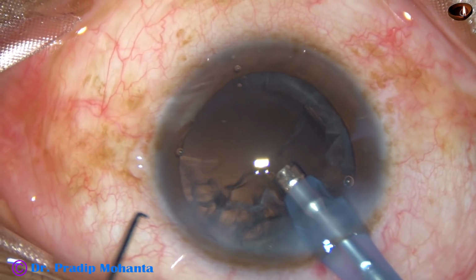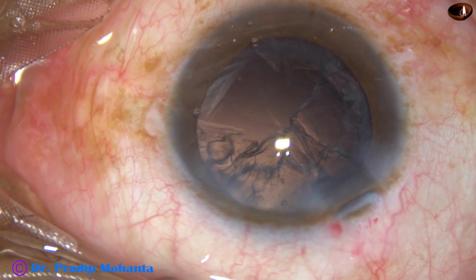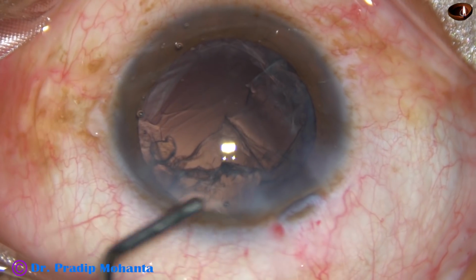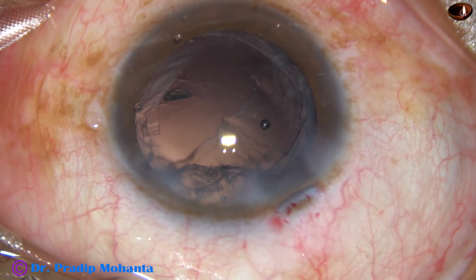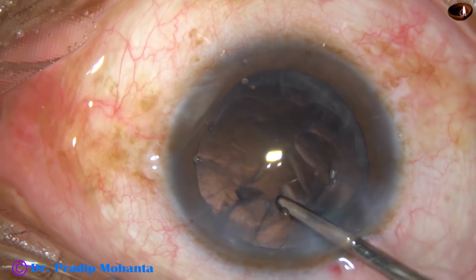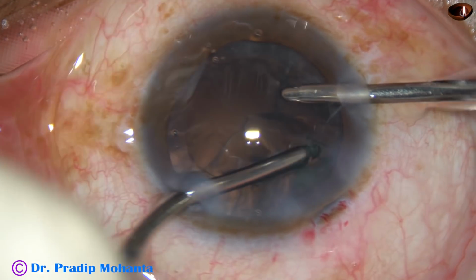Be very meticulous, very careful, take your time, protect the corneal endothelium, protect the posterior capsule, inject viscoelastic substance in between whenever you need, and do a safe surgery. I can do a surgery in 6 minutes, in 8 minutes. You may take 20 minutes, doesn't matter. Next day your cornea should be clear, the patient should be happy, you should see the smiling face of the patient, and you get tremendous satisfaction from surgery.